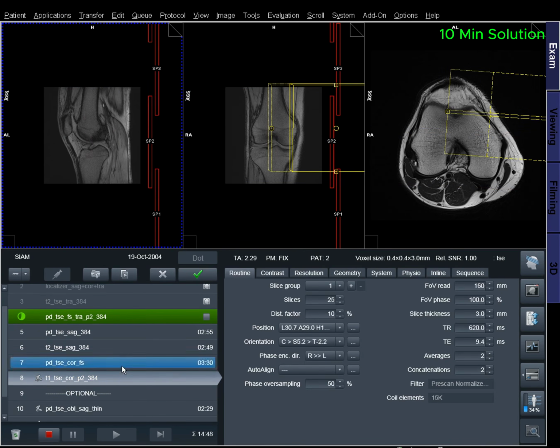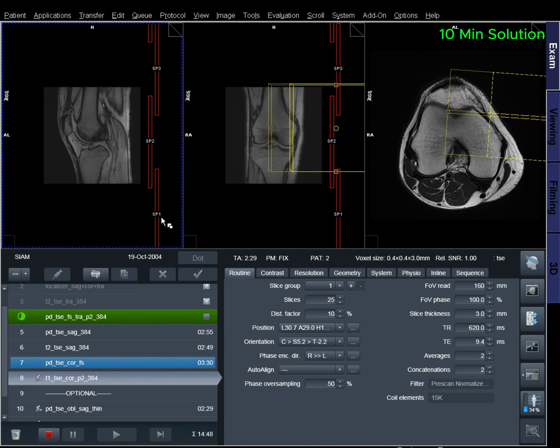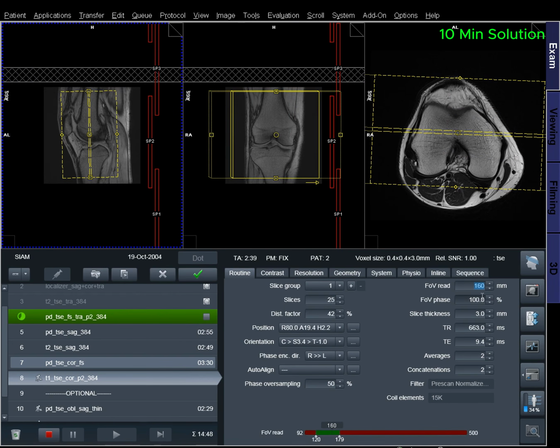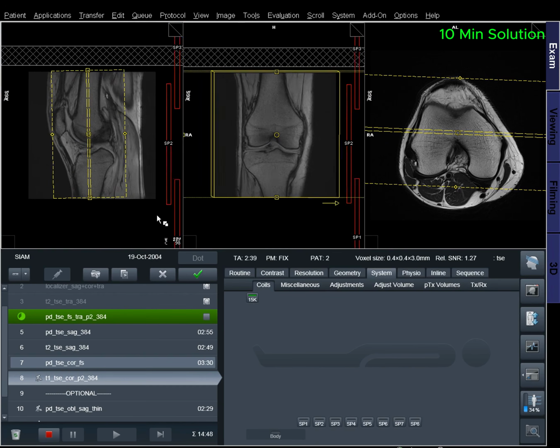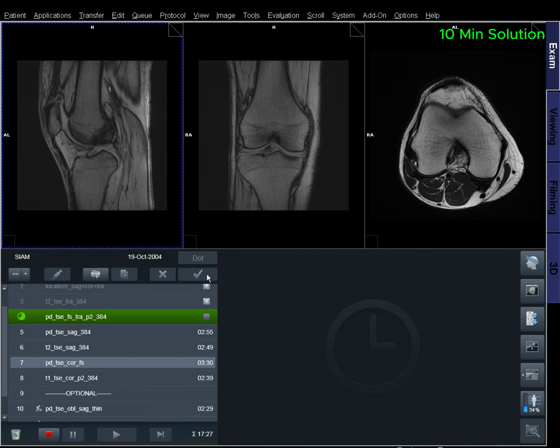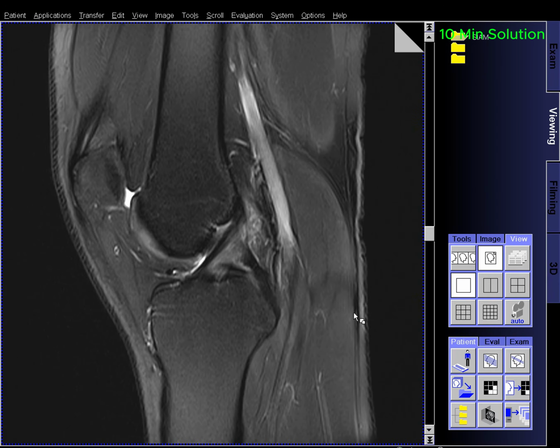Common indications for MRI of the knee: meniscal disorders, non-displaced and displaced tears, discoid menisci, meniscal cysts, marrow abnormalities, avascular necrosis, marrow edema syndromes, and stress fractures. Congenital and developmental conditions, Blount disease, dysplasia, normal variants.